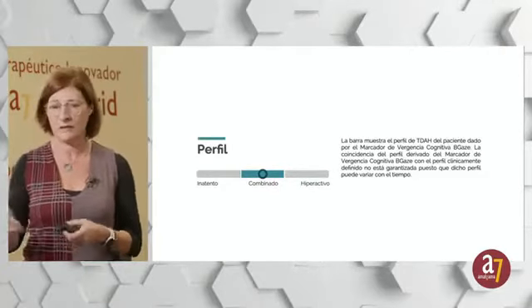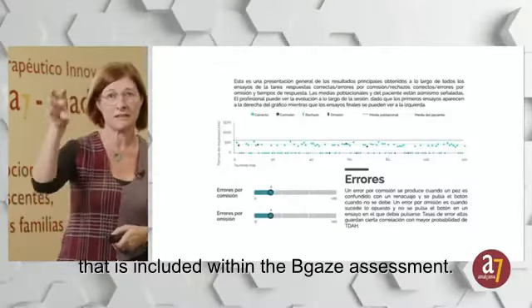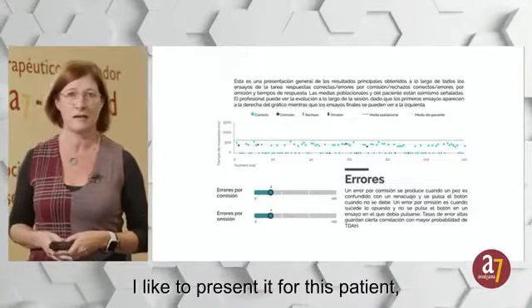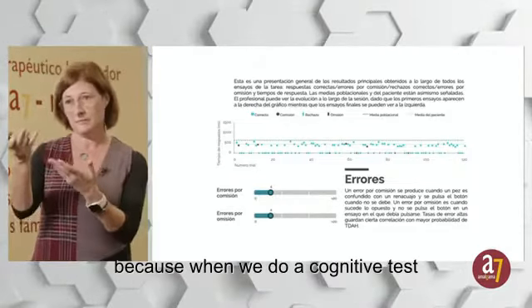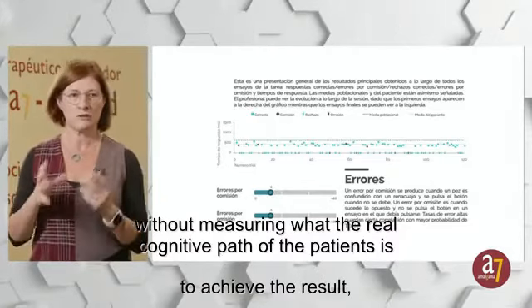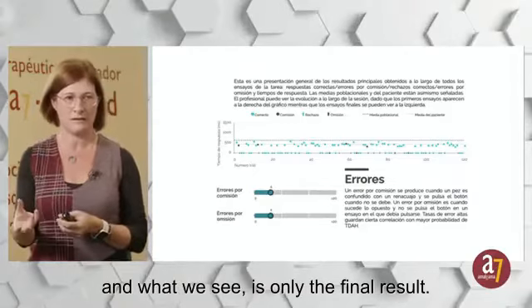This is a CAPTAIN, a continuous performance test, that is included within the BGaze assessment. I like to present it for this patient, because when we do a cognitive test, without measuring what the real cognitive path of the patient is, what we see is only the final result.